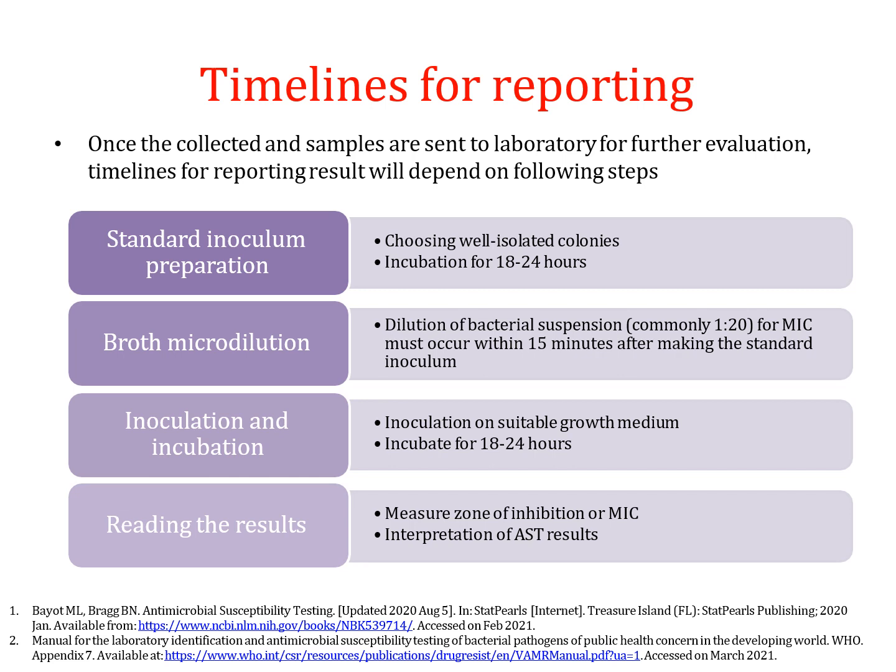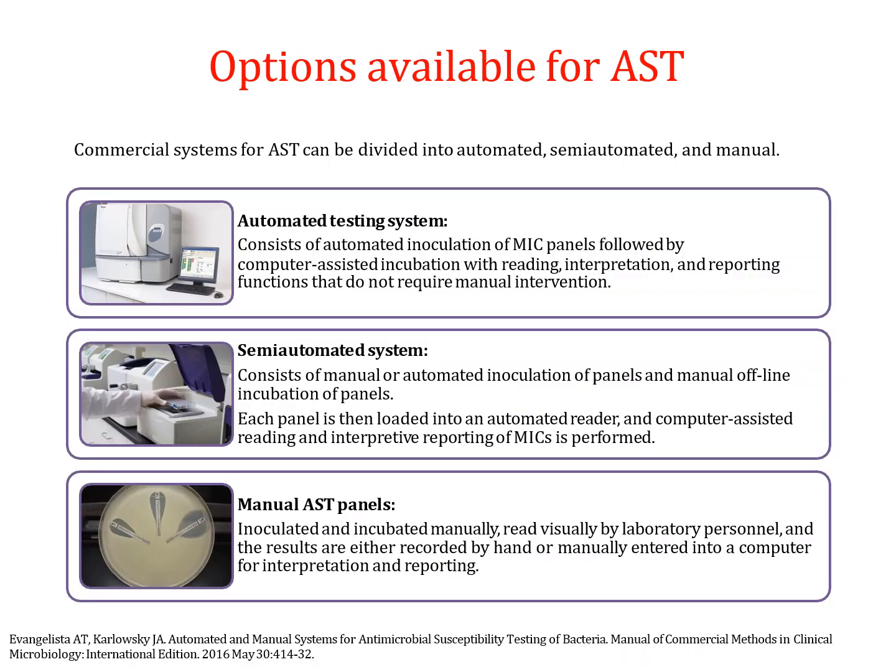Then reading the results takes place after about 24 hours of incubation, wherein the zone of inhibition or the MIC values from the broth dilution are noted, and the values are then interpreted based on CLSI and EUCAST guidelines. We have automated methods like Phoenix and Vitek, which are based on the principle of broth dilution, and they have automated readings of MIC panels.